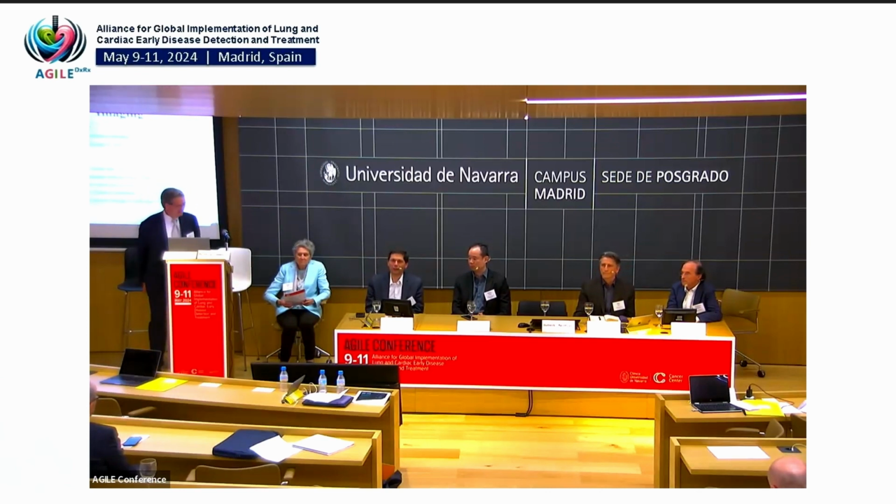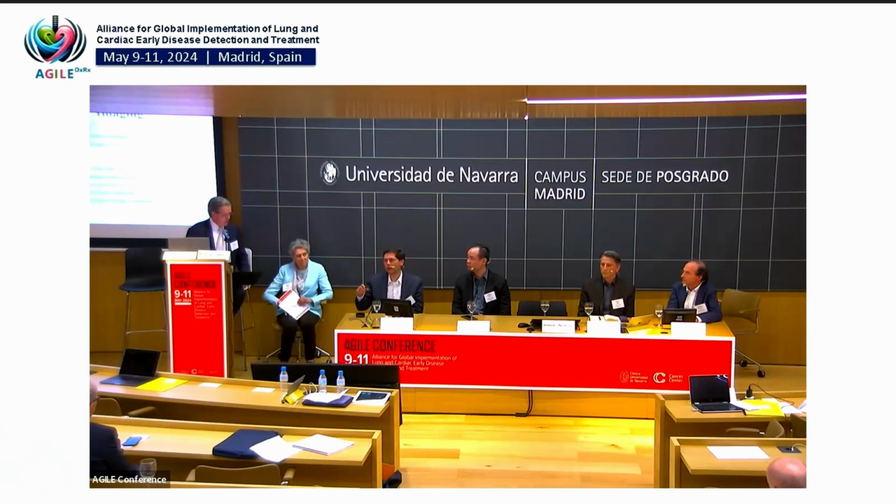What I'm referring to is that precision is regarding if you take a measurement numerous times, what's the standard deviation of that measurement? And the bias is how much does the mean differ from what you know is ground truth, whatever the value was supposed to be. The truth is that when we do lung cancer screening and we're measuring small lung nodules, it's both the precision and the bias that matter.